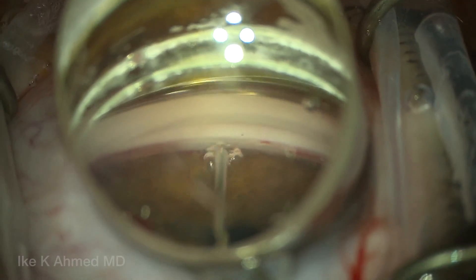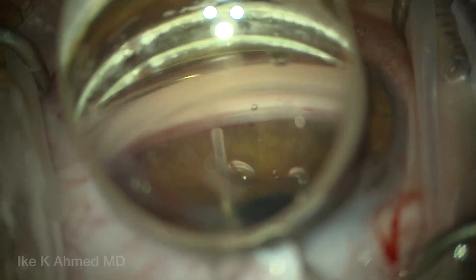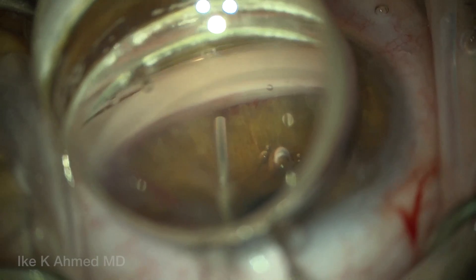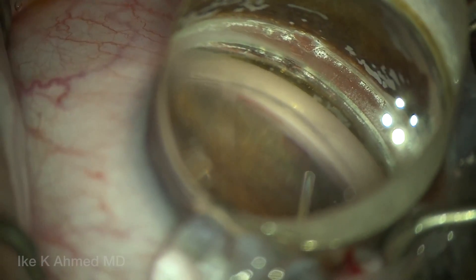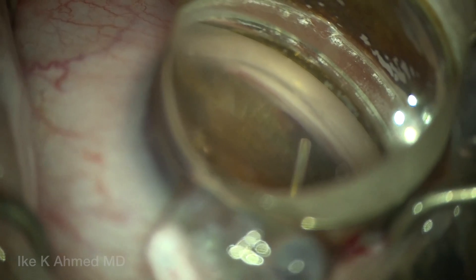This has resulted not only in viscoelastic expansion, but also actual cutting and incision of the inner wall, providing aqueous outflow directly into the aqueous outflow pathway. We can see viscoelastic injected here into the eye, showing areas of blood reflux where those collector systems are present.